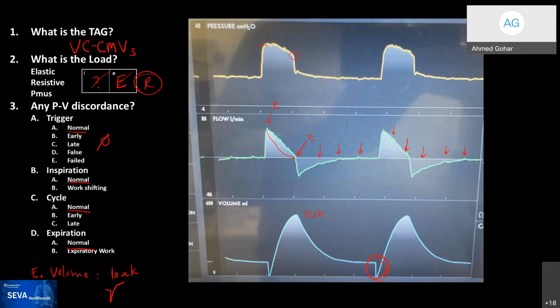The second thing is, I feel like I would have more control as well in terms of being able to maximize the flow, and that would decrease the I time as much as I can, besides obviously decreasing the rate and everything.